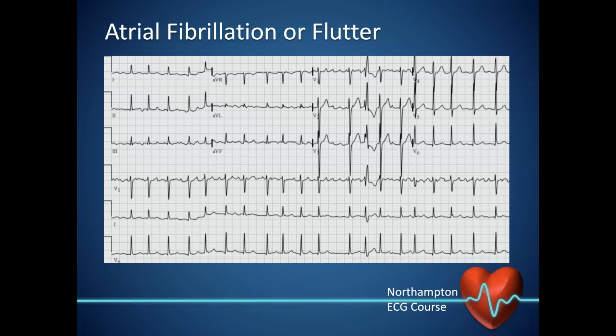So this is a really good one for that. When you get a slow conduction, and the other pathway, say the right bundle, has not recovered enough yet, the conduction prefers to go through the left bundle, so you get a right bundle branch. It's just gone out of my head. It will come to me.